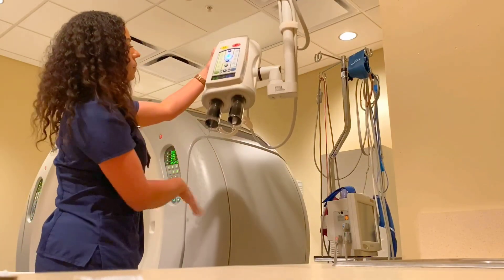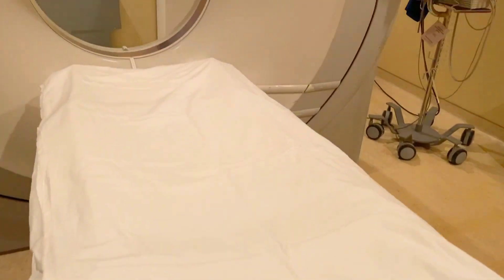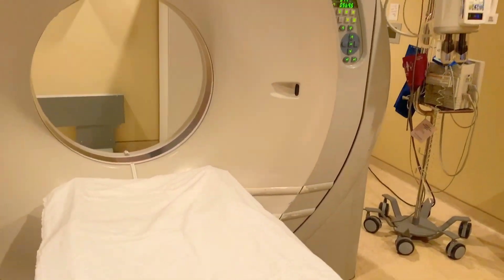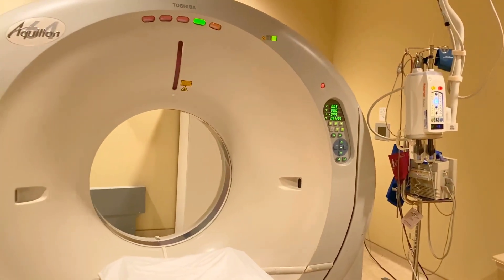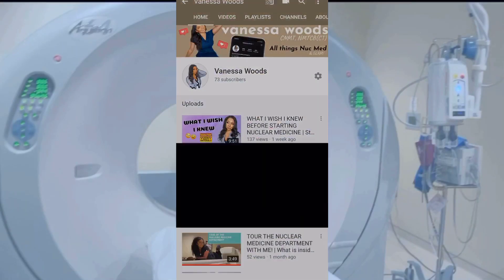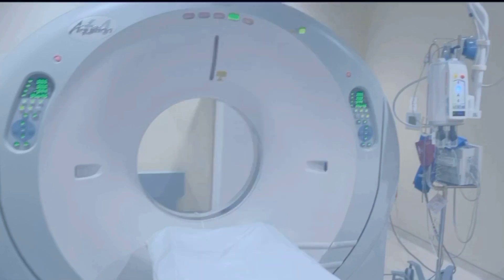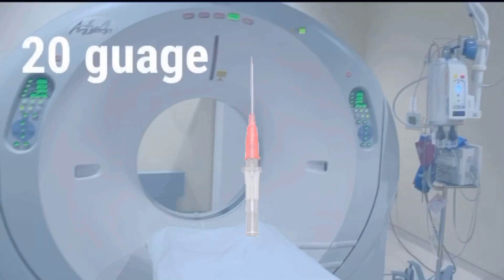Our power injector is prepped and now we are pretty much ready for the patient. When we get the patient we may or may not have to start an IV — I actually have a whole video on my page about how to start an IV, you should check it out.